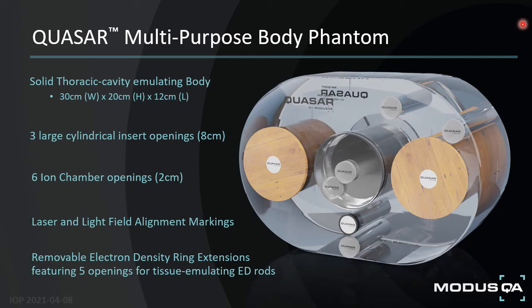However, a specific location to note are the ones located at the spine or bone placement here, and this allows the user to select a more appropriate spine depth for your patient plan, thereby providing a little more customizability in testing an actual given SBRT treatment plan, but we'll be touching upon this a little bit later.